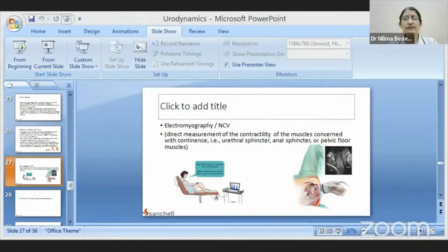So whenever we say we will do all these studies, we will get all the interpretation when we combine these reports with our own clinical findings. From here, we get to know how to evaluate and interpret this clinical evaluation in the urodynamic test. So we'll go through how to interpret the symptoms and what the findings are, so that we can apply our skills for determining the management part.